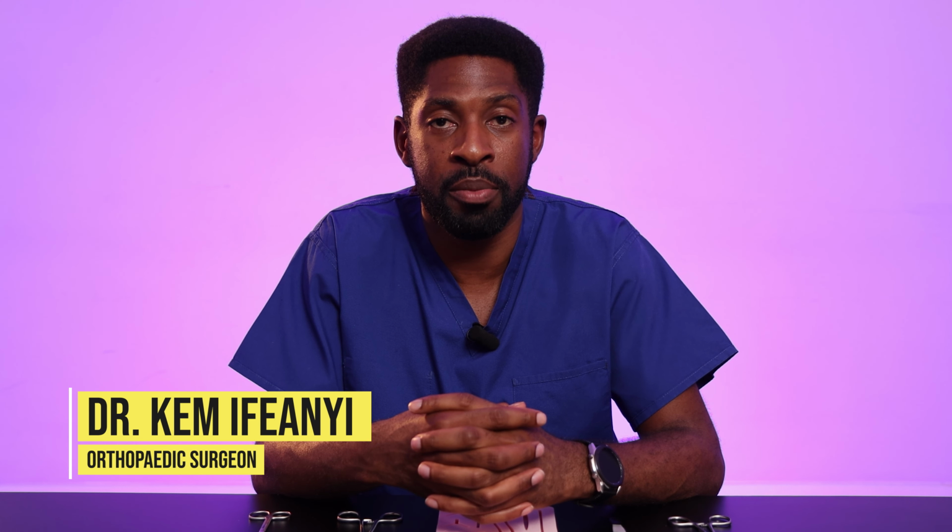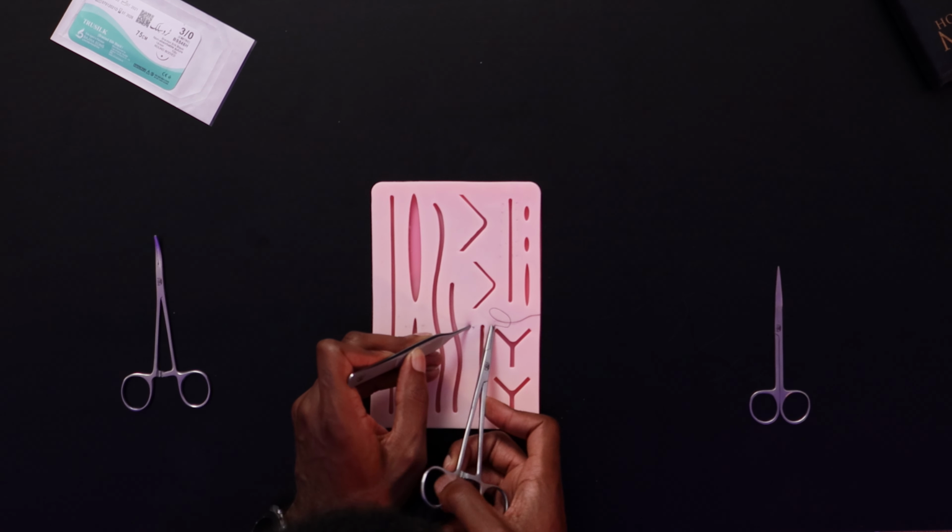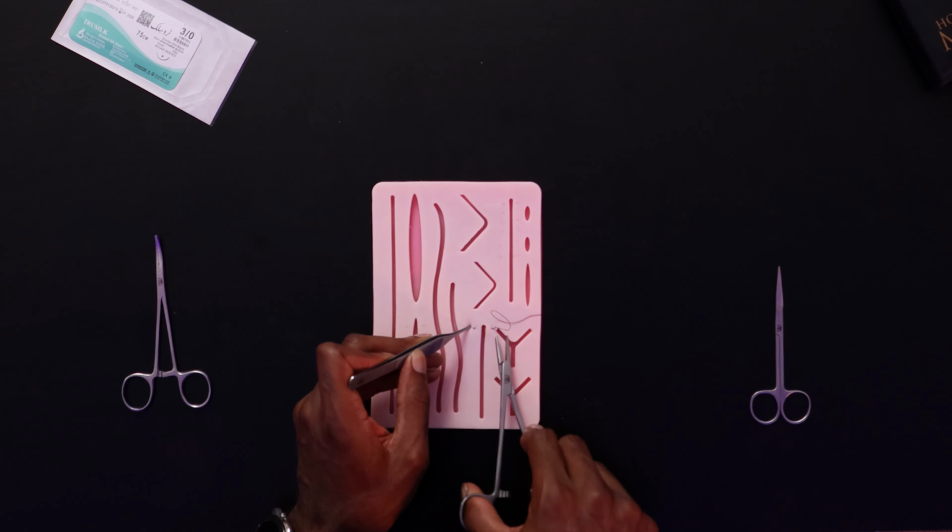So once again, tip of the needle at 90 degrees to the skin and pass through to the other side, using the curve of the needle to advance through. When your suture material is long, you can place your needle down and pull through until you have adequate length for you to tie with.